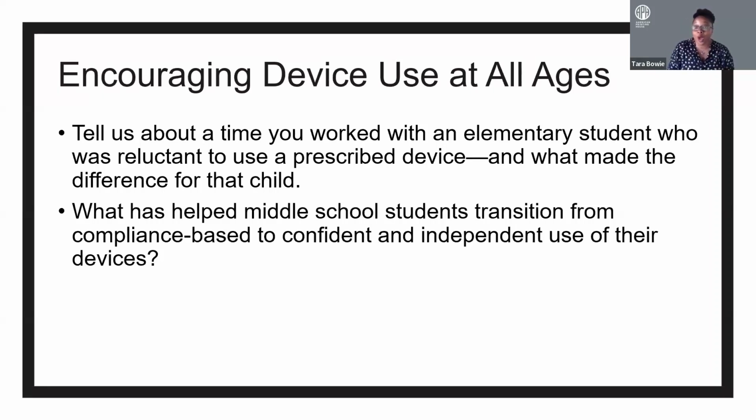Well, the early start is you hope to get them in elementary school using these devices already. But we've also seen where they'll use it in elementary and then decide in middle school, no, thank you. What I have found with some of my middle school students, and I've told parents and other teachers this, is it really is a maturity thing, as to where they are in that level, and you meet them where they are. A lot of my students have moved to electronic devices that other students are using. It might be an iPad, it might be their laptop, and every now and then they might pull out a magnifier when they need it, or a monocular device.